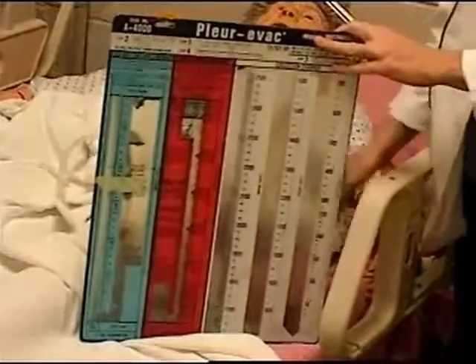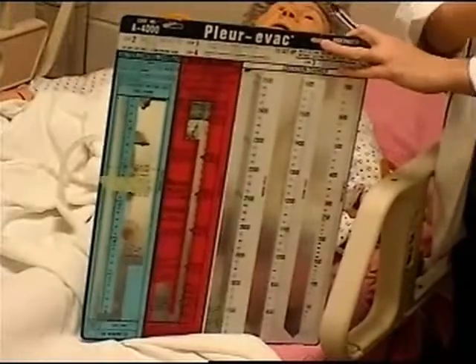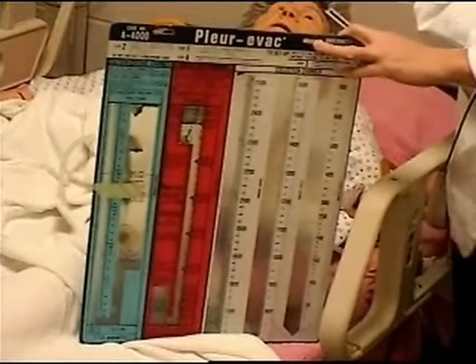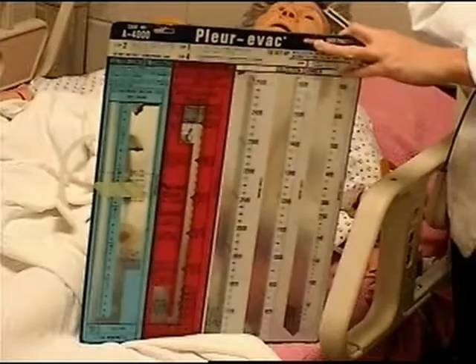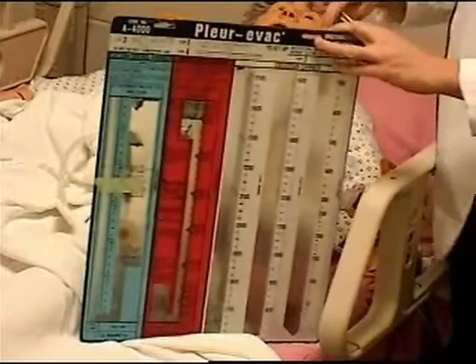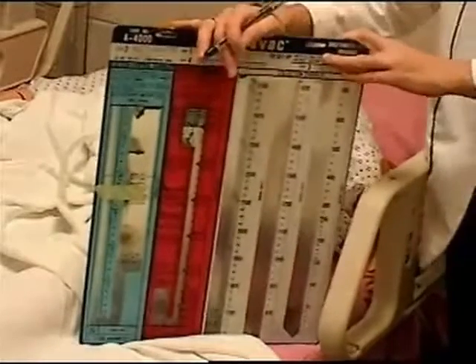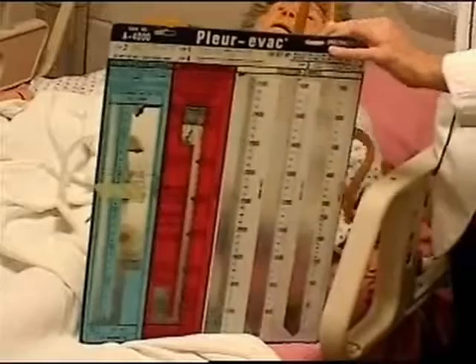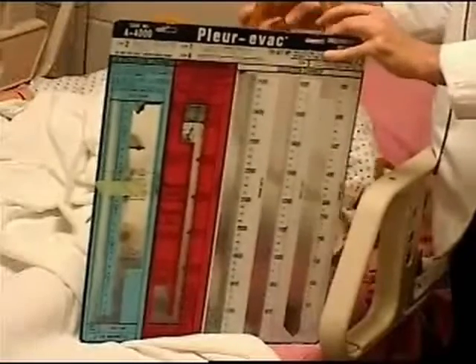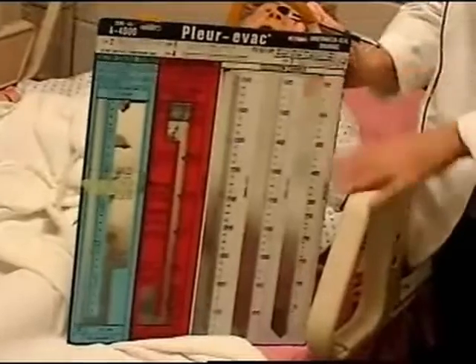Initially what the nurse will do, and this would be the RN, will take a padded clamp and they will clamp it closest to the dressing. If it stops leaking, then there's something with the chest tube. If it continues to leak, then it's somewhere from where you clamped it down to the machine. Either there's a hole in the tubing, or the tubing's broke, or there's something wrong with the machine.